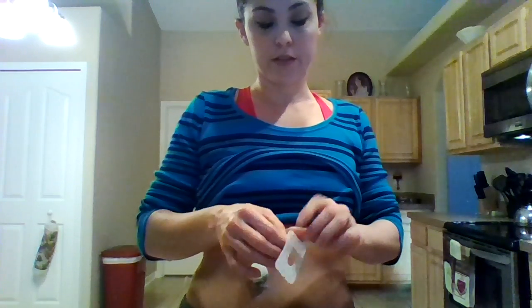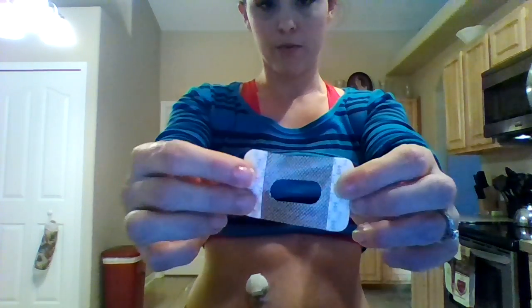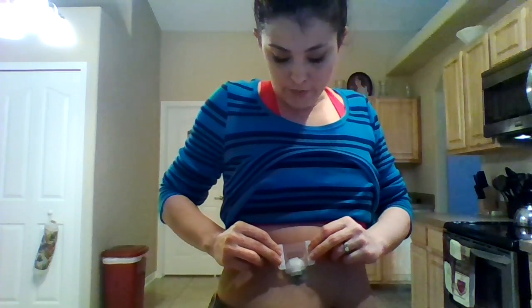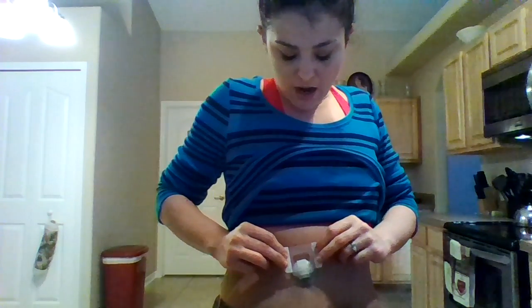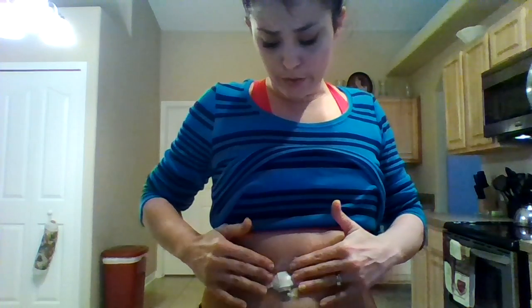So I take another piece of the Enlite over tape, and I take the backing off. Again, it's the same exact thing with the hole in it. And this time I put it over the top of the transmitter, and I leave a little bit of the hole so some of my skin can breathe right here. But this just holds the transmitter in place that much longer.